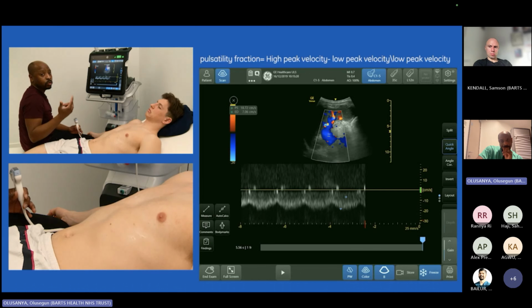So breathe normally. Deep breath in for me now. Breathe out nice and slowly. Then hold your breath for a moment. Okay. Once you've got breath like this, pulse wave. Breathe normally.